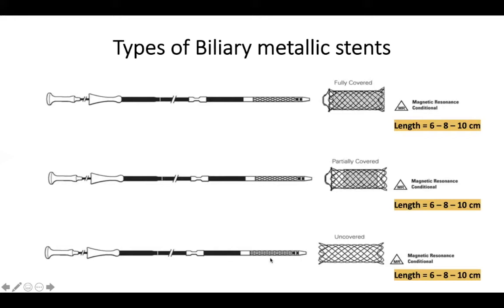Each stent is retracted in its sheath, and has radio-opaque markers at its distal and proximal ends. Of course, these stents are inserted over a guide wire after stabilization of the guide wire inside the biliary system. There are different available lengths for each stent, whether 6, 8, or 10 centimeters, according to the length of the stricture inside the biliary system.